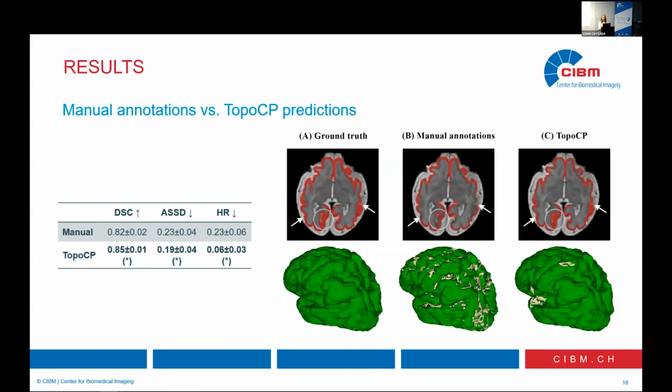annotations. So they were actually performed one slice every second or third slice. They are annotated on the brain every second or third slice, and then they interpolated, which resulted in very noisy annotations.